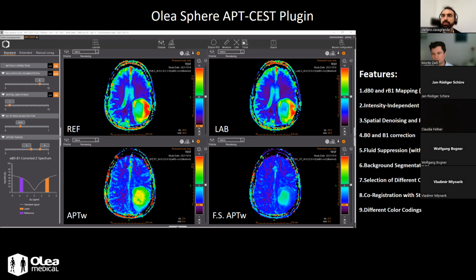This is also able to correct with good success the volumes that have low intensity around 0 ppm. Finally, we also perform spatial denoising with wavelet and PCA denoising. Of course, if we acquire more volumes, the PCA denoising will work better.